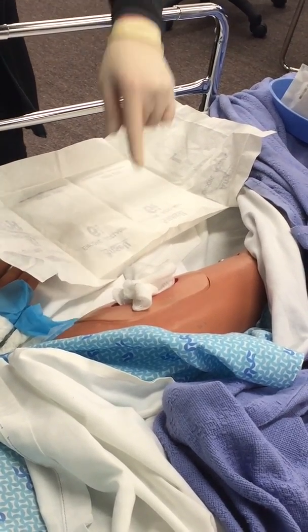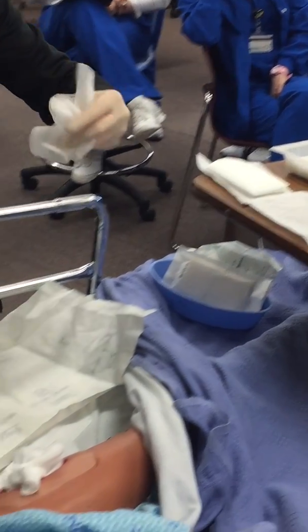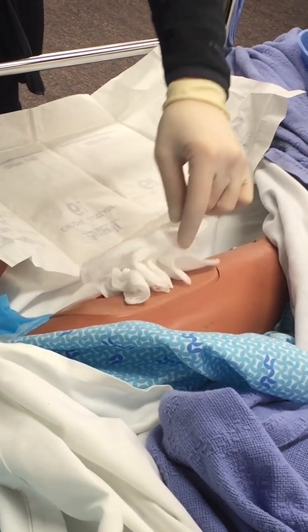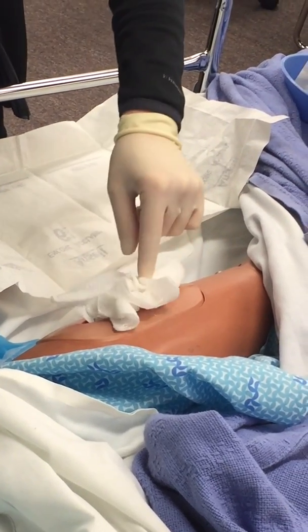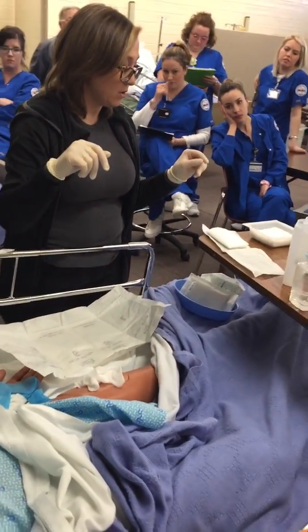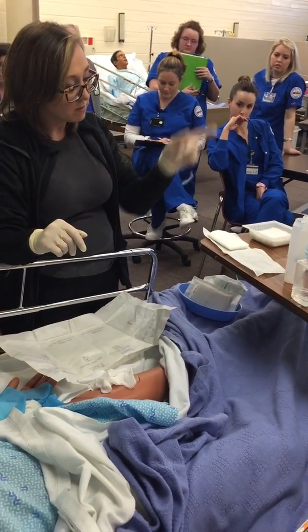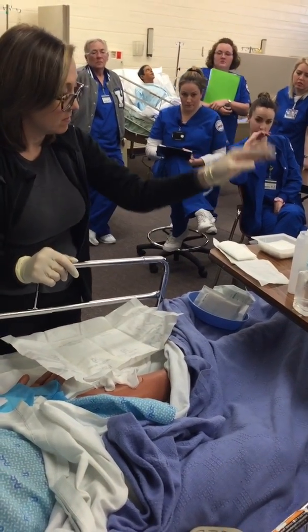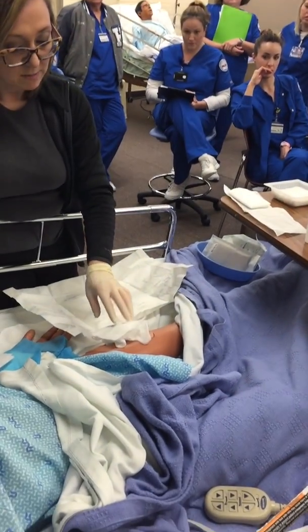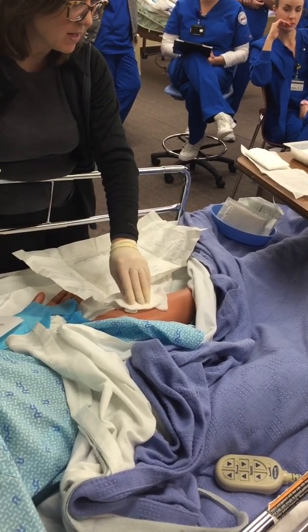You're touching the gauze that's going onto the wound, correct? All right. So I'm going to put one more on here. Maybe one more. Stay right there, little gauze. Okay. Then if you would like to, you can use the overdressing here. Is this hand still sterile? Okay. Can I reach here? Okay. I'm taking this out. I'm going to place this over. And it's just a matter of dressing it. There's really no method to madness.